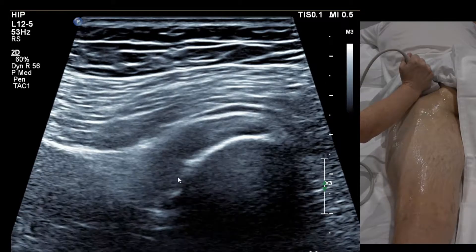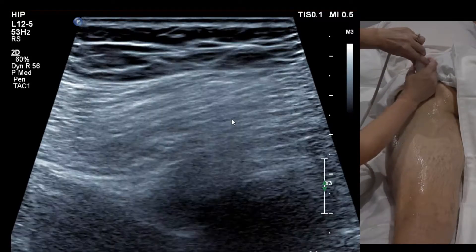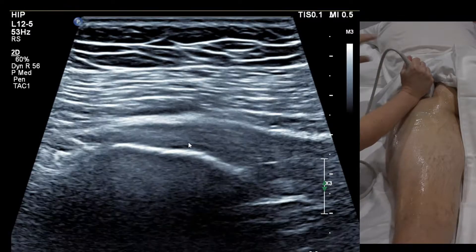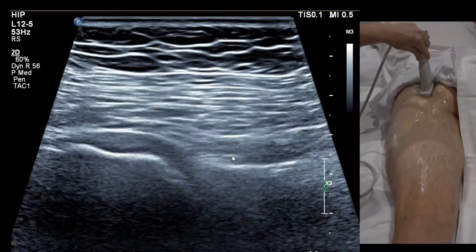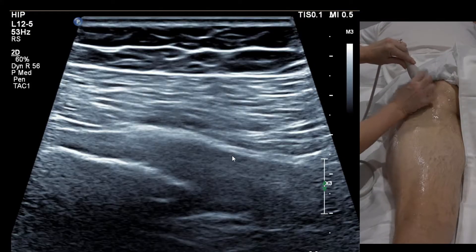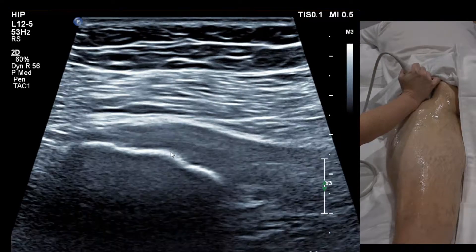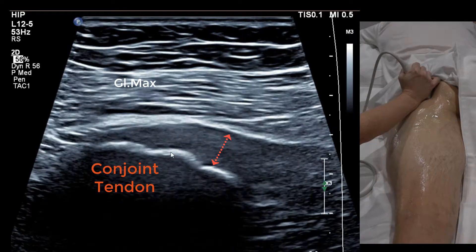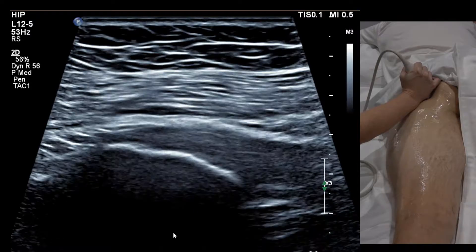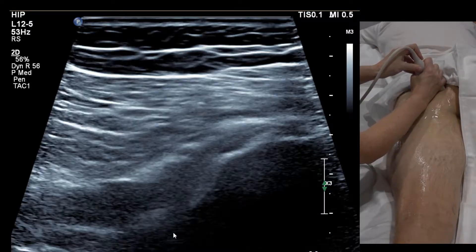In longitudinal on the conjoint tendon up here, it'll look like a triangle. The best picture comes from a lateral approach rather than a vertical probe orientation, because the tendon curves around the lateral side of the ischium. You could measure it in long, but it's easy to get any measurement — so the more reliable approach is to take a transverse picture and compare tendon depth with the other side.